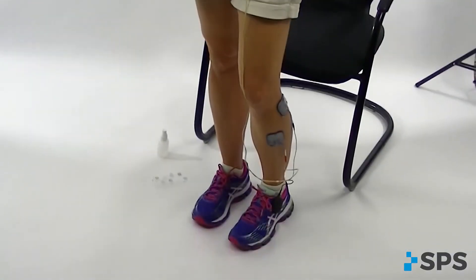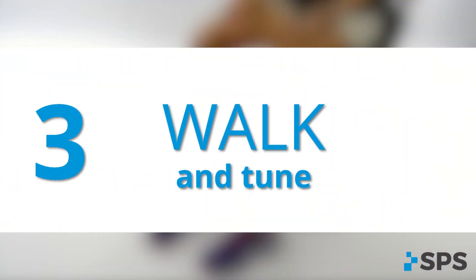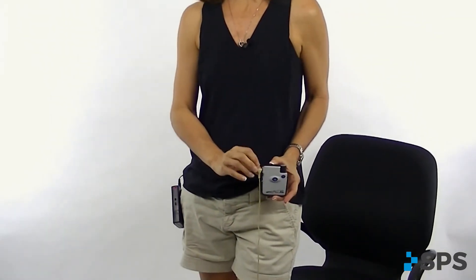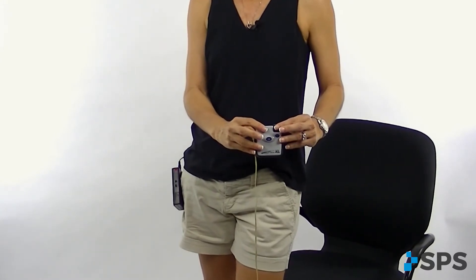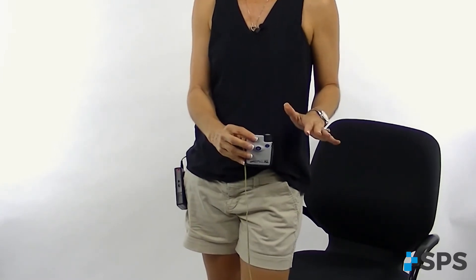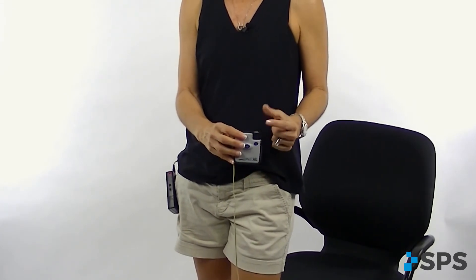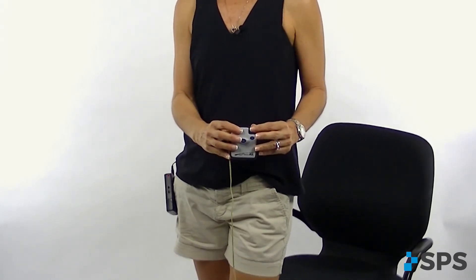We'll hear the Bluetooth pair and now I can walk. After taking that first walk I've observed the gait pattern and assessed whether or not the program parameters are set correctly so that the stimulation timing is appropriate. Now I can look back into the settings and make any changes I want by simply scrolling the control knob to change the rising ramp, the extension time, the falling ramp, or any of those settings discussed in the setup menu, and select them by clicking the knob and making adjustments by scrolling. Once done with all settings, I'll click exit and let my patient walk.